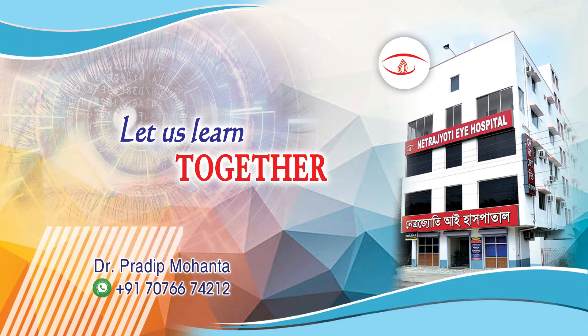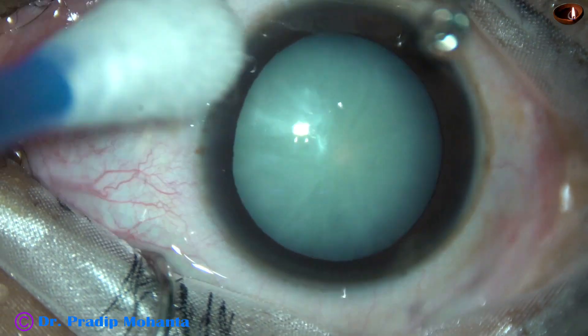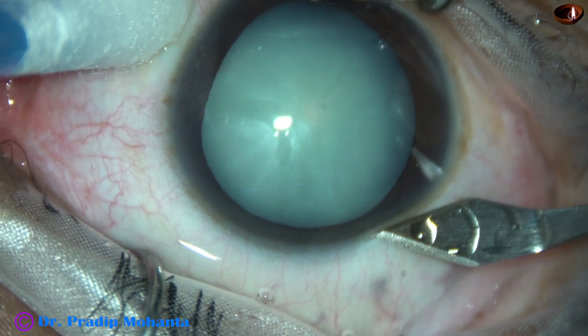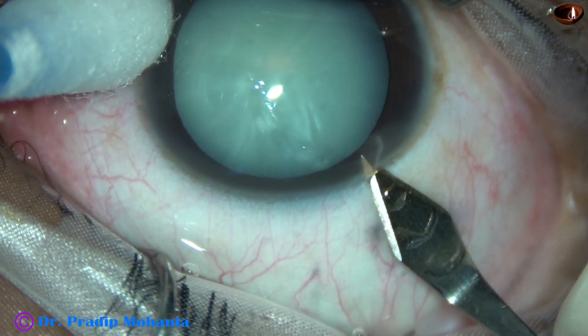Friends, welcome to my workplace at Ranagh Heart, West Bengal, India. In this video, we are going to see whether the corneal endothelium gets stained with trypan blue dye or not when the air bubble is not used or when the air bubble doesn't stay in the anterior chamber.